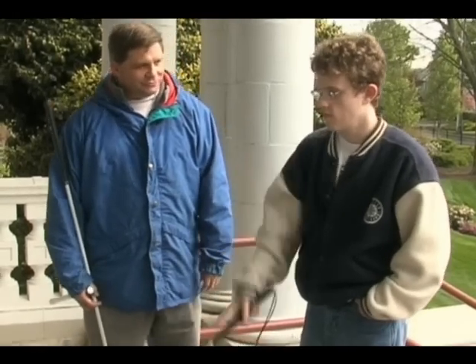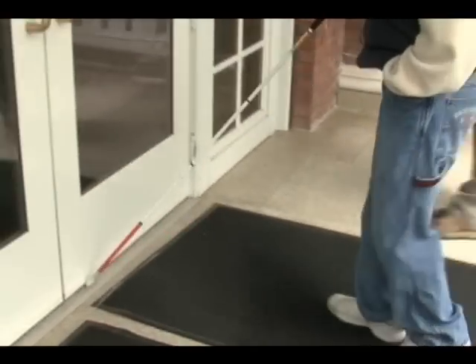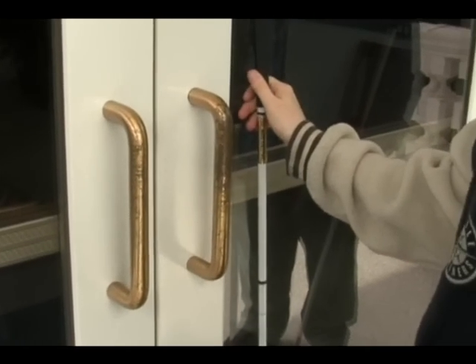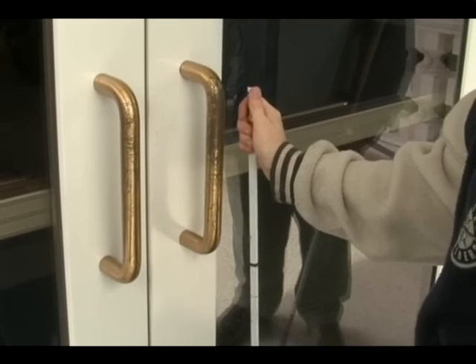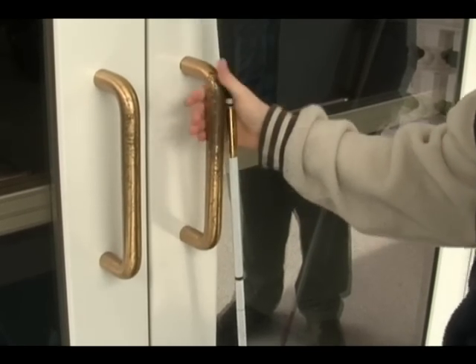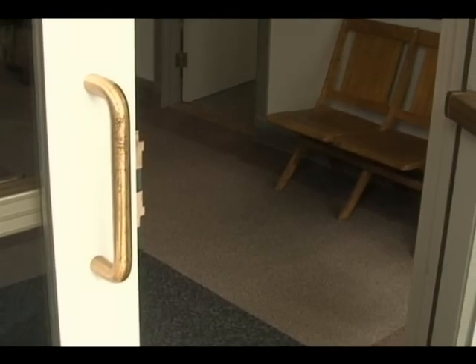Tyler, today can you show us how you use your cane and your cane hand to find the door knob or handle of the store without using the other hand to feel around for it? Sure. So you found the door. You brought your cane up, Tyler? Yes. And now what are you doing? Now I'm bringing my hand down to the bottom of the grip area, or the shaft of the cane. And — door handle. So you slide your hand over until you find the door knob or handle. Yes.